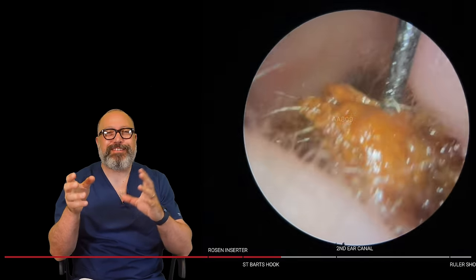Check this ruler shot out though, guys. Look at that. Now, I normally line the pieces up side by side, but I knew I was going to run out of ruler space, so I just bunched them all together there. So look how the depth on that as well. That's 9 centimeters, 3.5 inches worth of earwax that came out of both those, well, earwax and skin. That's without the debris that you can see on the left-hand side of the paper as well. Whew. That was a tough one.